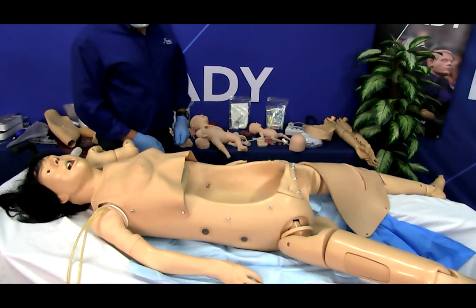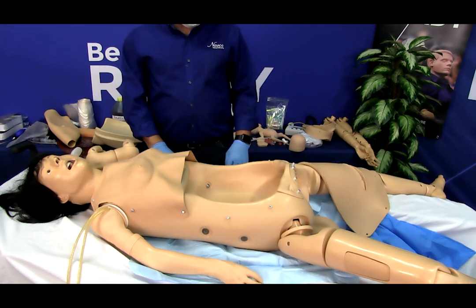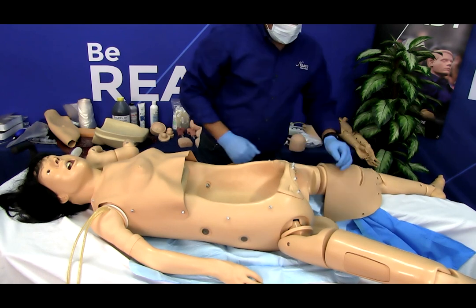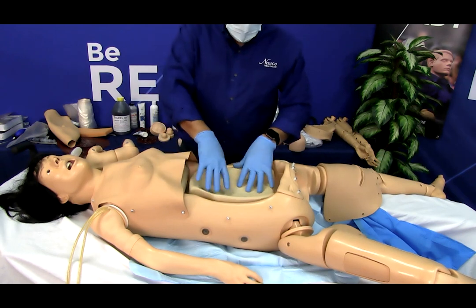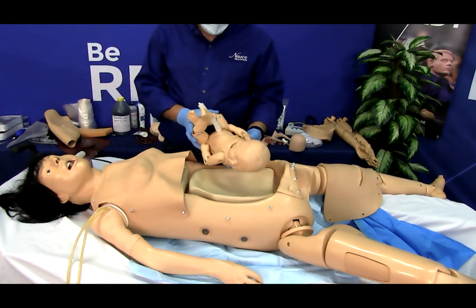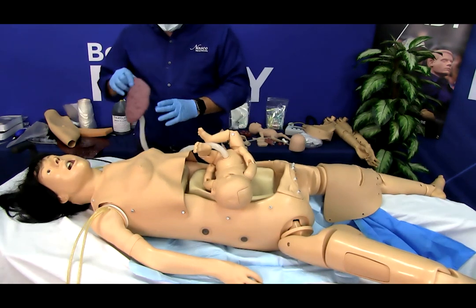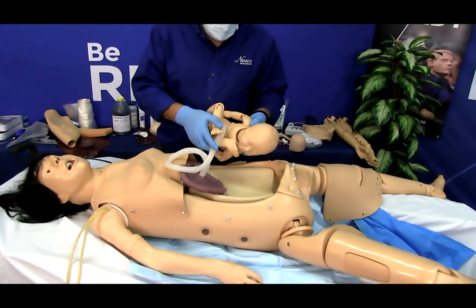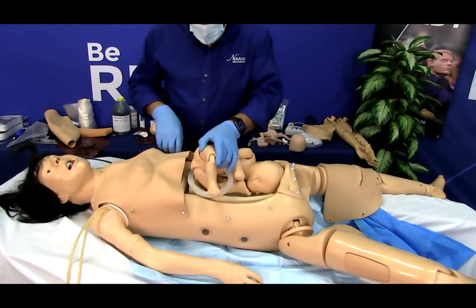To simulate a cesarean section, it is important to note not to use the abdominal pad in this scenario. Remove the perineal skin foam stabilizer pad and place the pelvic block in the abdomen. Position the articulating fetus on the pelvic block as desired. You may connect the umbilical cord sections and placenta to the fetus if desired. Please note, the placenta cannot be attached to the abdomen with the pelvic block in place. Simply lay it elsewhere within the abdomen.